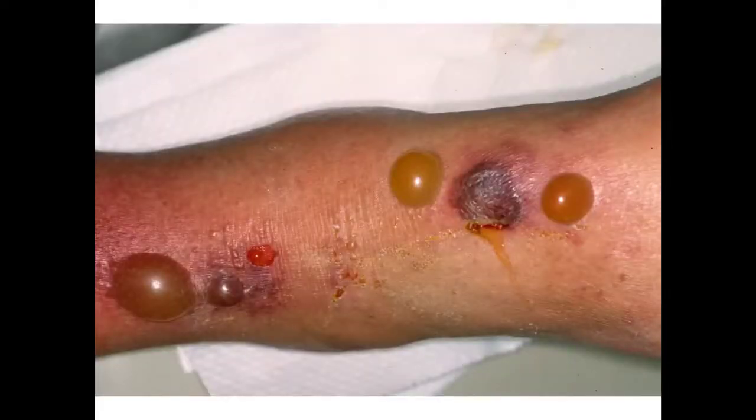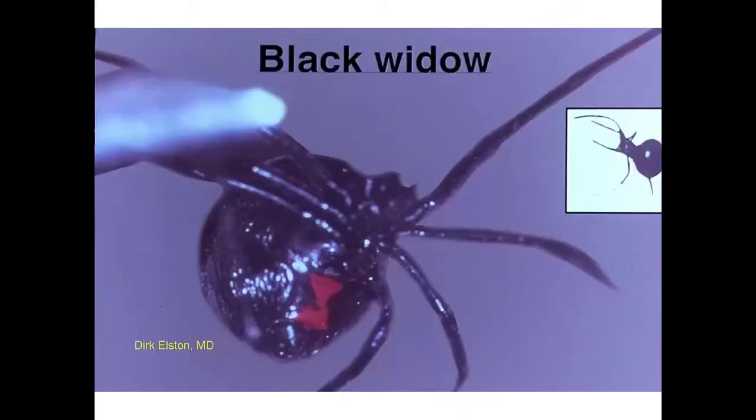Okay, what's your thought? Mostly inflammatory bullae. Think about tense or non-tense? Tense, so like BP type things. Yeah. About arthropods, BP would be high, but would bullous arthropod, right? We just looked at arthropods. Remember, bullous arthropod can give you a false positive DIF, especially scabies. Right?